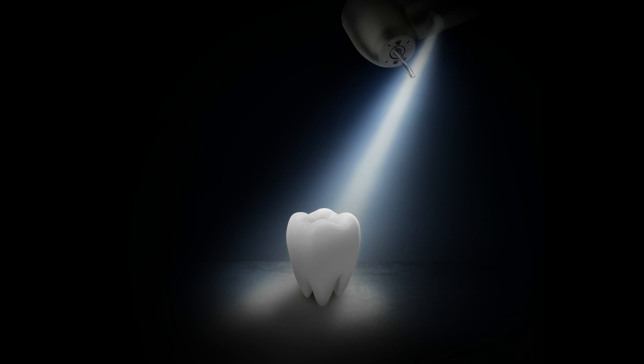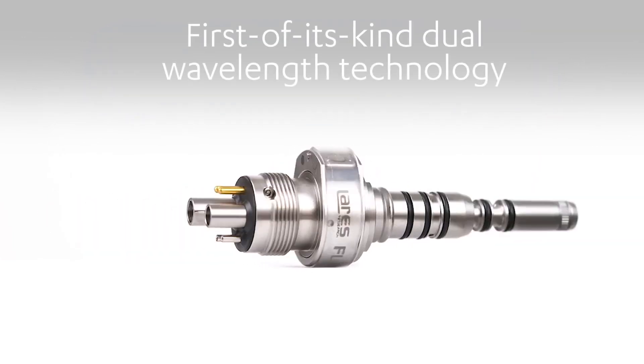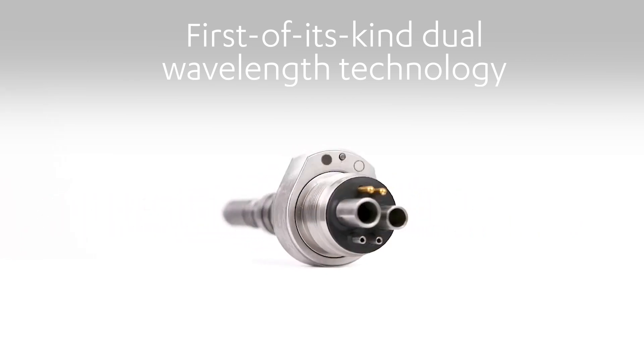Ever feel like you're working in the dark? That ends today. See dentistry in a new light with Floress HD. Introducing Floress HD, dentistry's first of its kind dual wavelength technology is revolutionising the way dental professionals excavate caries and restorative materials.